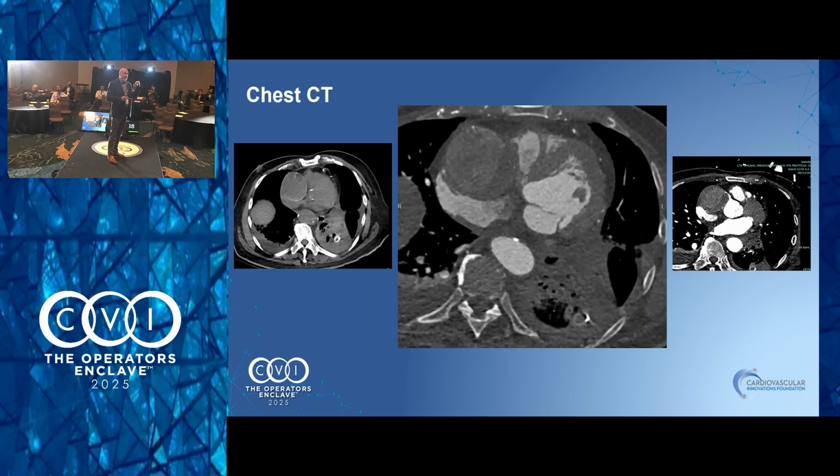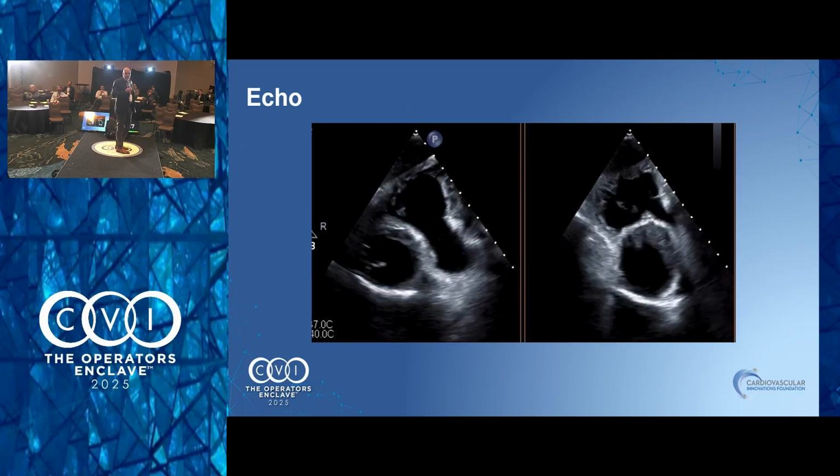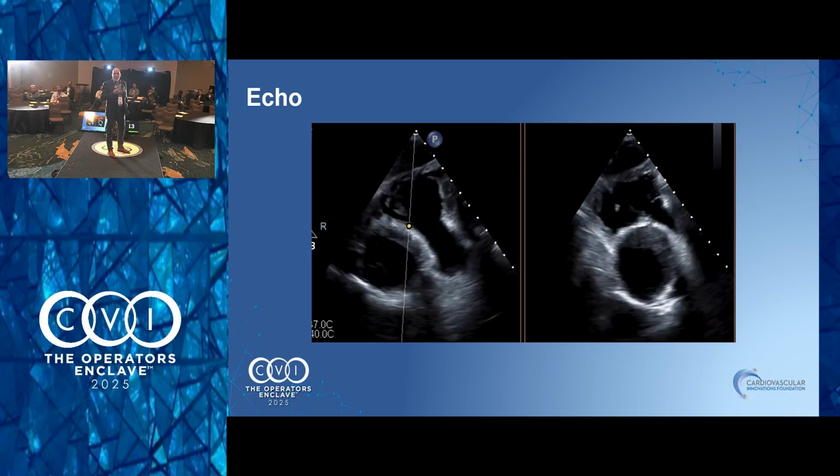But I did go back and look at a CT. The CT report said nothing about anything like this. But I went back 6 months prior, and there was a smaller version of this there already. He had never had a coronary intervention. He had a cath, but no coronary intervention. I figured I'd show this because I knew Nadira would be here, but I think we're just seeing this mass.